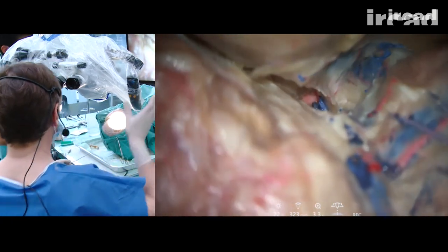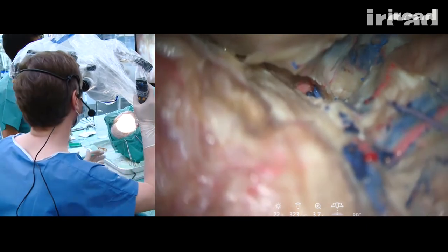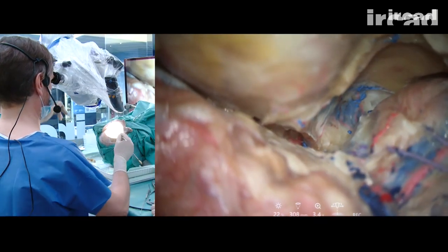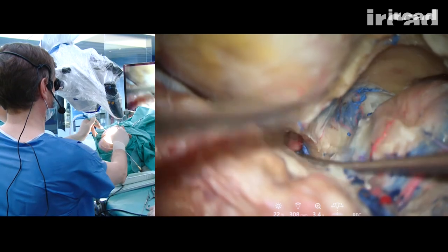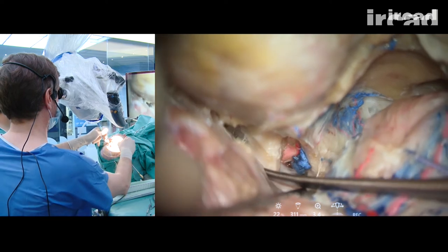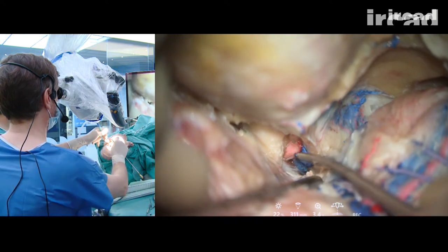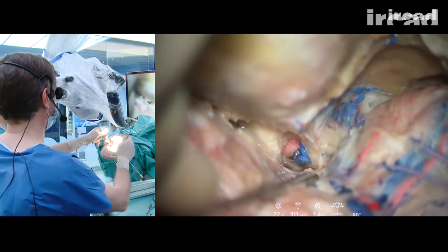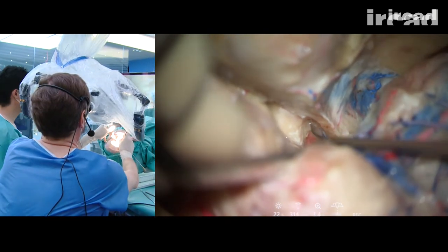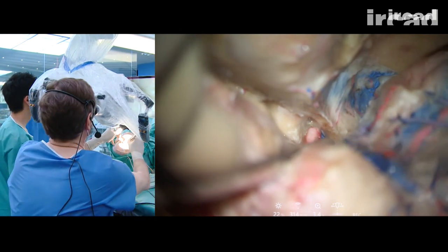Okay. So, a few minutes to expose more of the cavernous sinus. Okay. So, optic canal here. Clinoidal segment, optic strut. As I said before, I think that this is here a pneumatization of the optic strut.